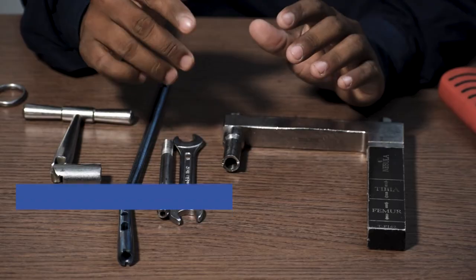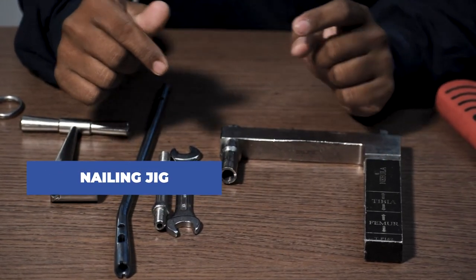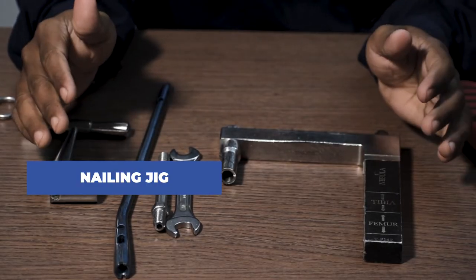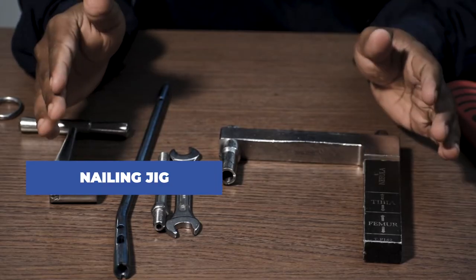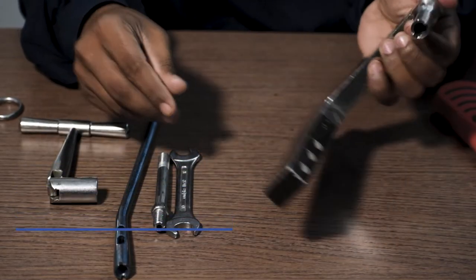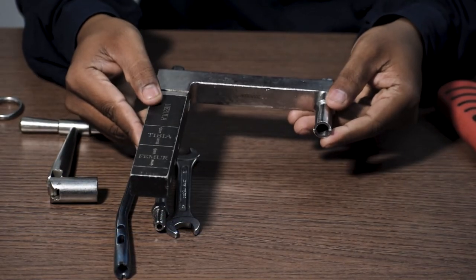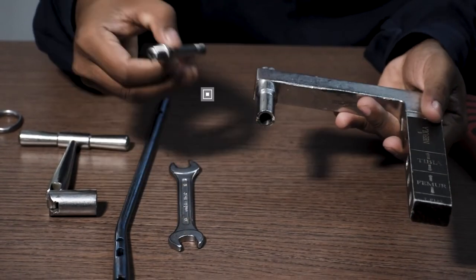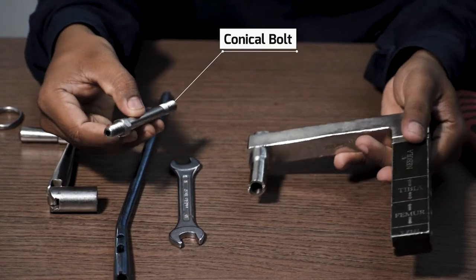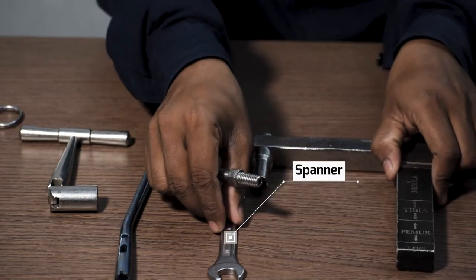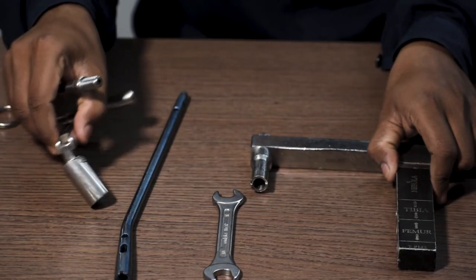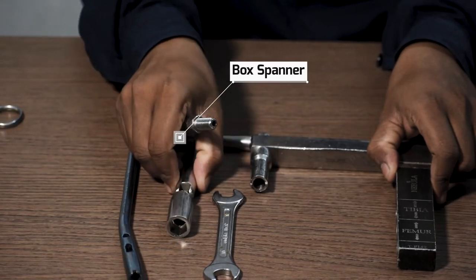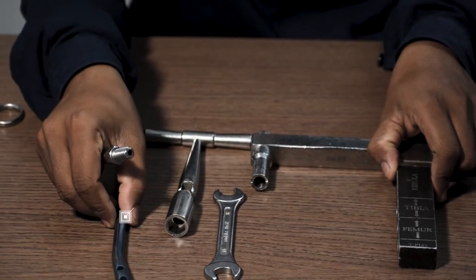Now let us come to the attachment of tibia nail with the help of a jig. This is a tibia jig. This is a conical bolt. This is a spanner. This device is called a box spanner. And this is the tibia nail.